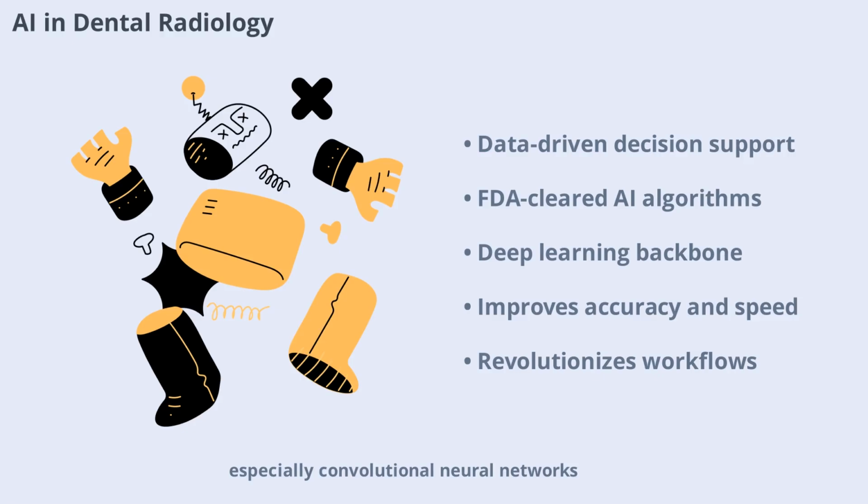Deep learning, especially convolutional neural networks, forms the backbone of these systems, enabling tasks like early caries detection, bone density assessment, and anatomical landmark recognition. AI is revolutionizing workflows, improving accuracy, and reducing interpretation time.